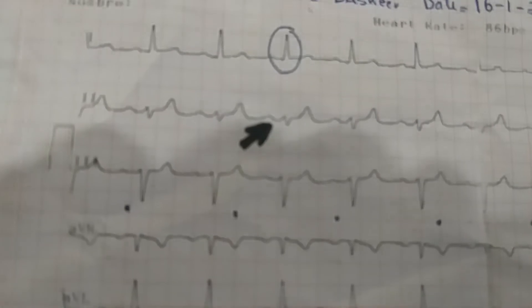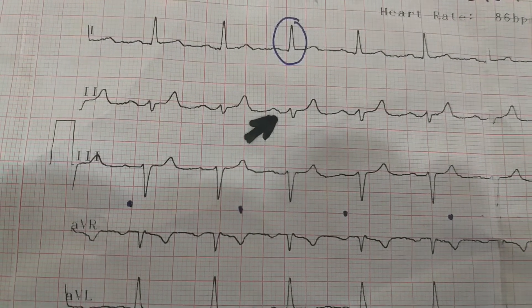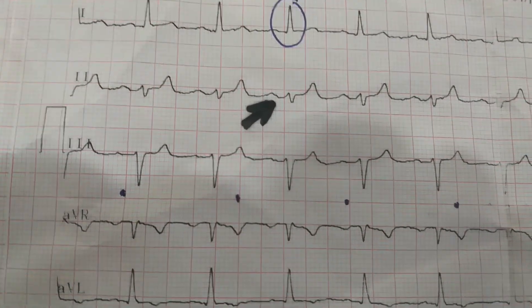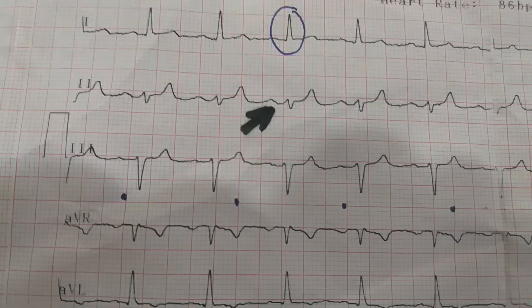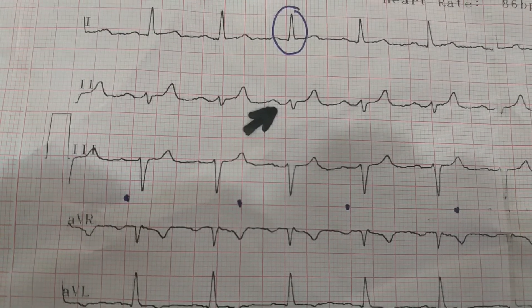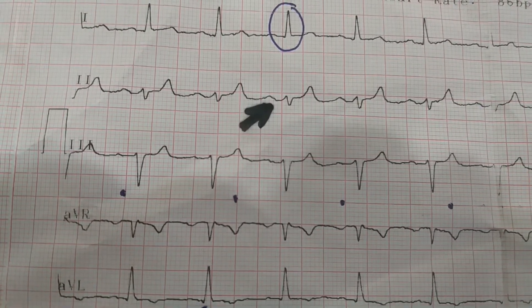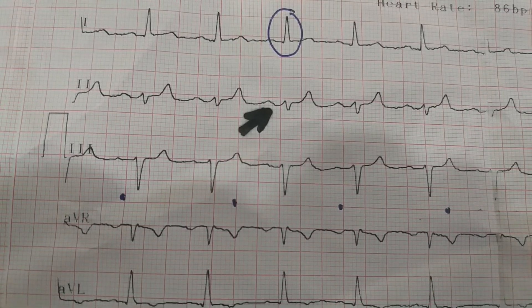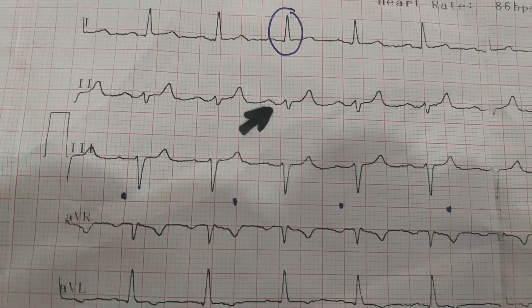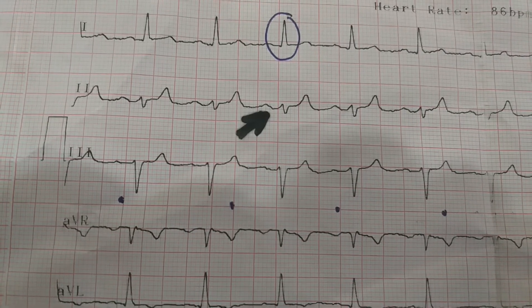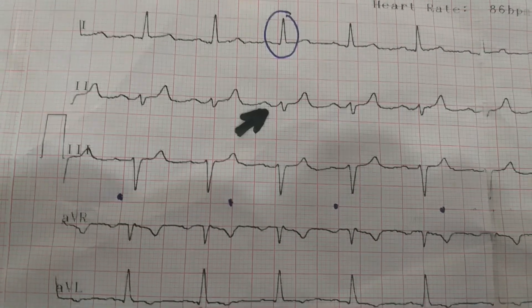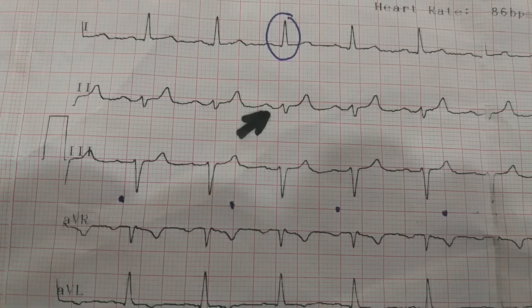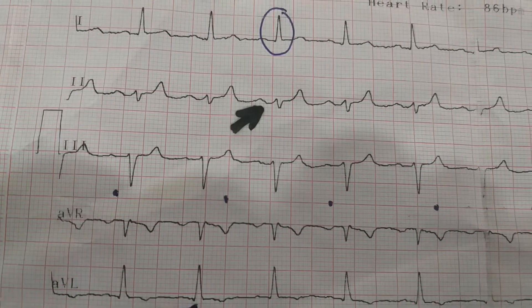In this ECG example, the black arrow is pointing towards the P wave in lead 2, which we call the rhythm lead. Looking closely, the height of the P wave is nowhere more than 2.5 small boxes, so this is well within the normal range. We can surely say this patient has not got right atrial hypertrophy.